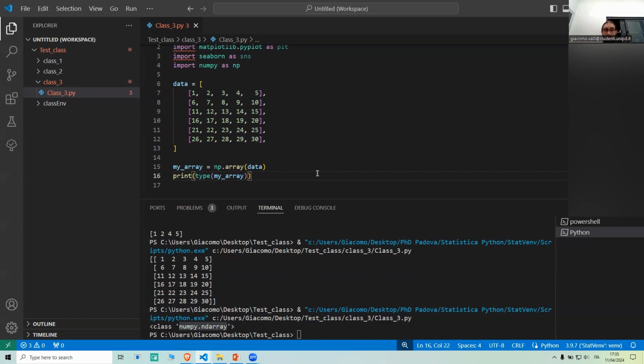So when you work with MATLAB, I'm doing this parallelism because I know that most of you only work with MATLAB, you can see written on your variable explorer what every variable is. You can double click on it and see what there is inside. But this is absolutely not possible in Python. There are some tools that are trying to allow you to go inside the data, visualize it with your eyes, but they are not working very well. And they have a lot of limitations, both in Python and in MATLAB.